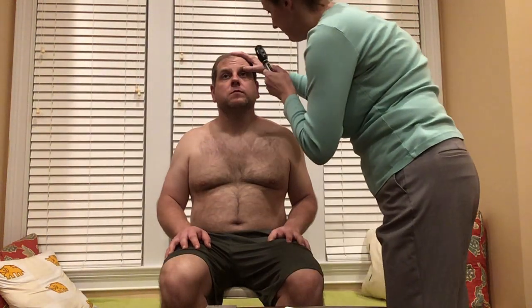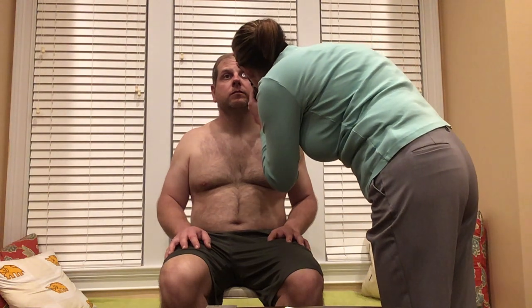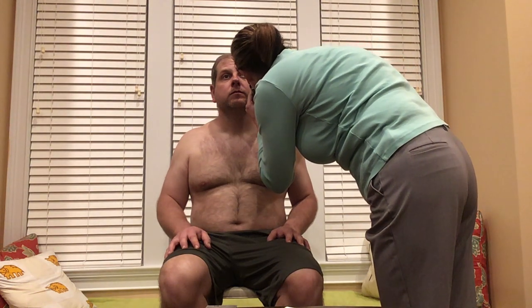Use the ophthalmoscope to assess for red reflex and internal structures and fundus. Excellent.